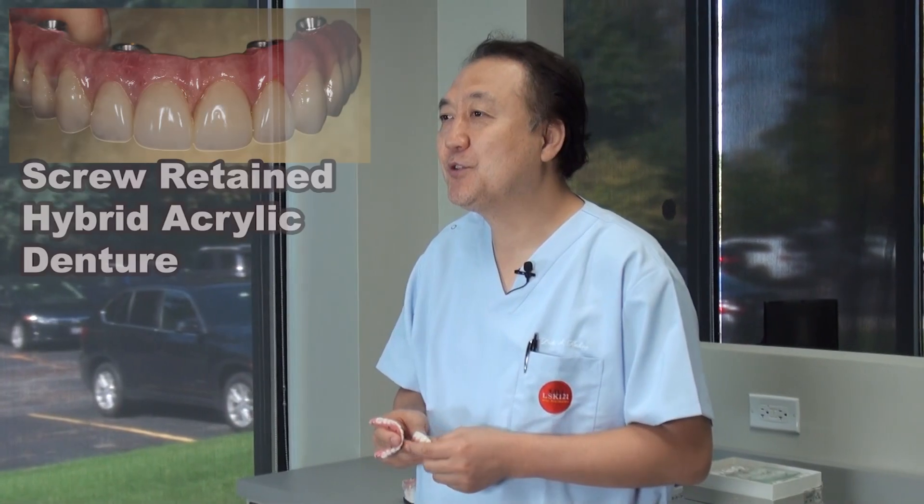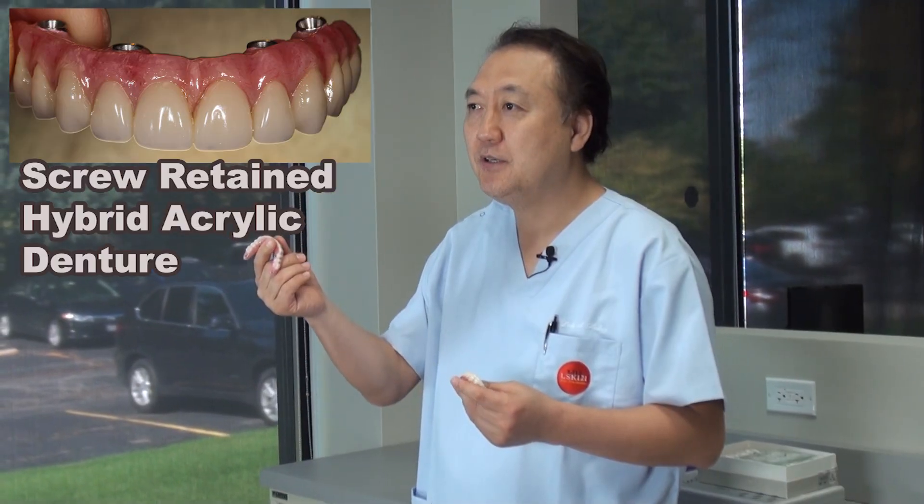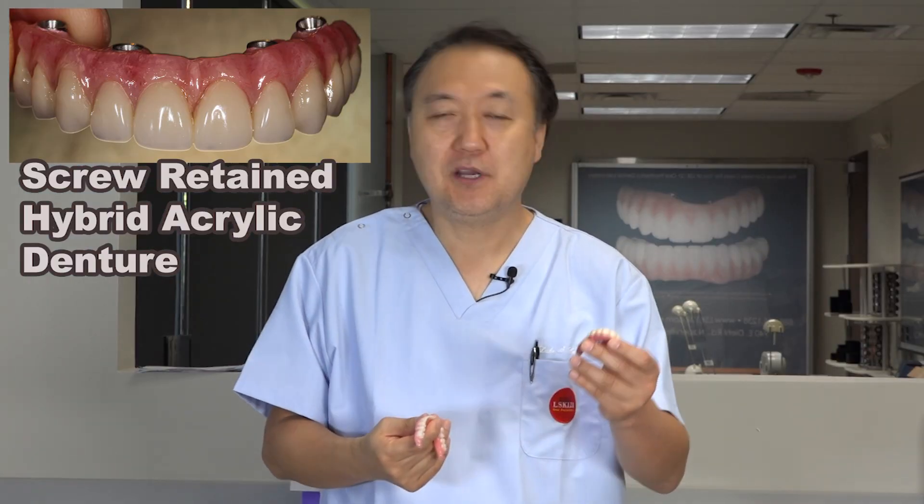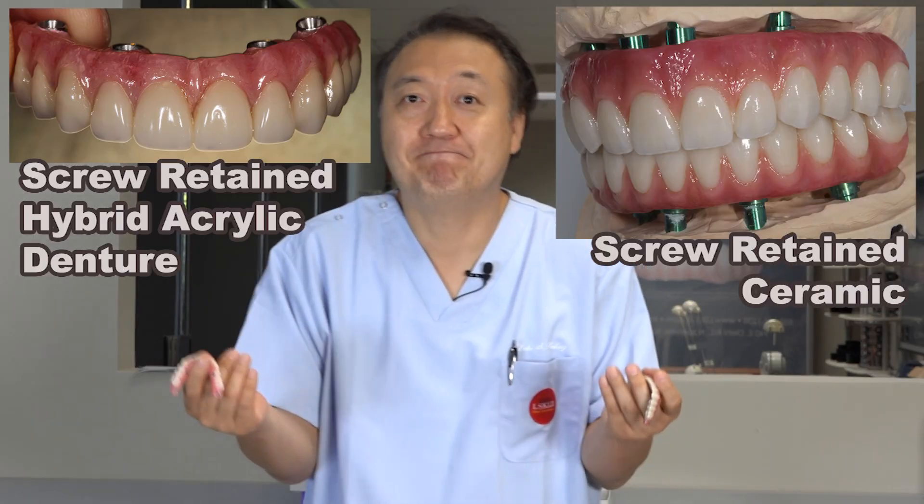Today's topic is worth it or not worth it — meaning screw-retained denture, screw-retained hybrid acrylic, compared to screw-retained ceramic. Which was worth it? Stay tuned.